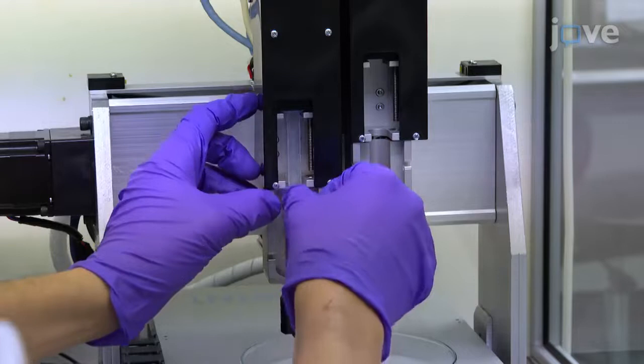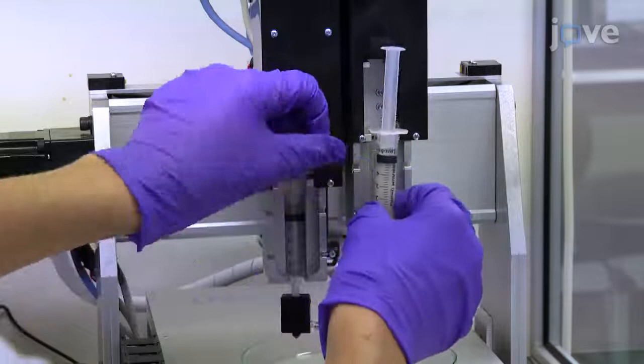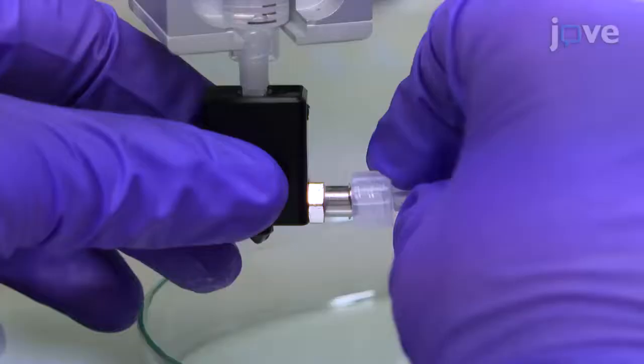Connect the syringe with crosslinking solution to G27 needle in the nozzle and load the syringe into one of the extruder mounts of an ethanol sterilized 3D printer. Mount the syringe with hydrogel into the second extruder and connect it to the nozzle.